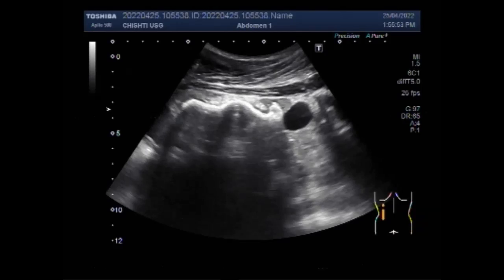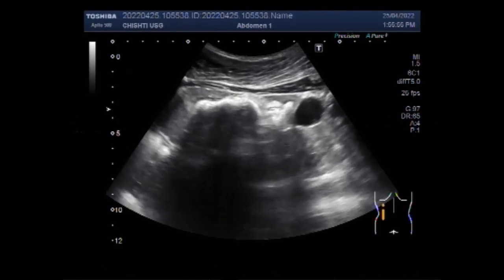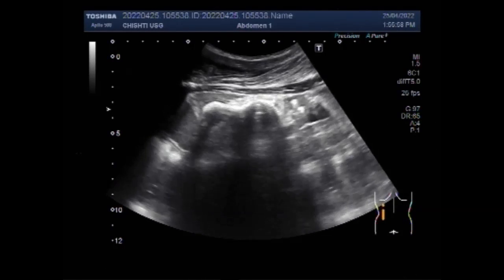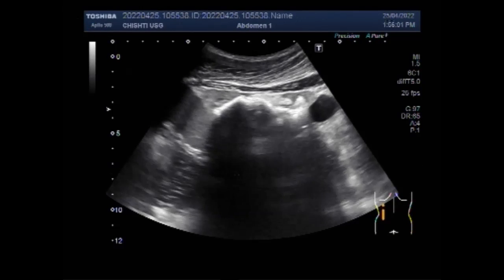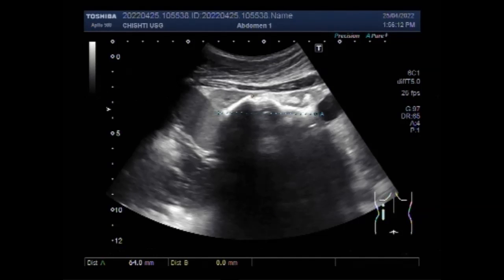Now you can see the left kidney, with the patient in the prone position. You can see the whole length of the renal pelvis is filled with multiple stones, and a large strong posterior acoustic shadow of these stones is visible.